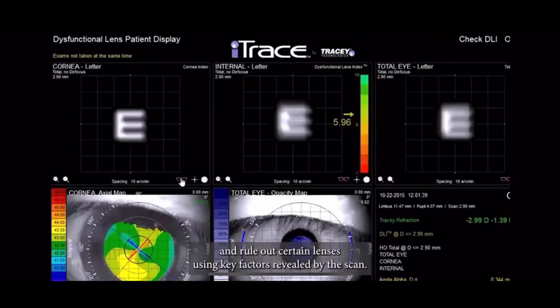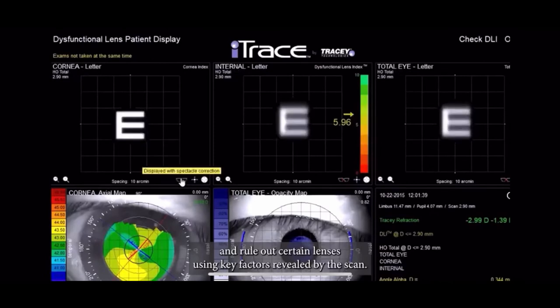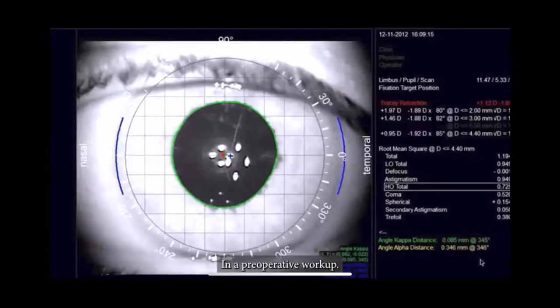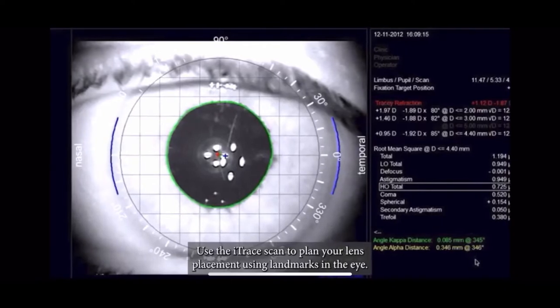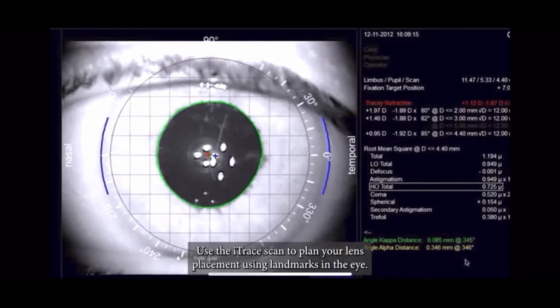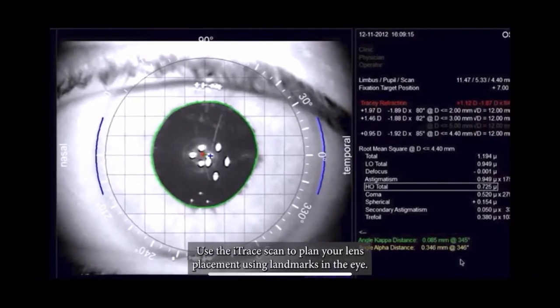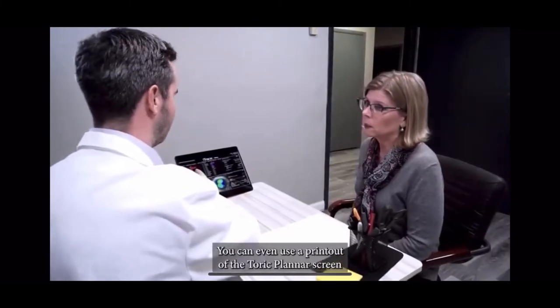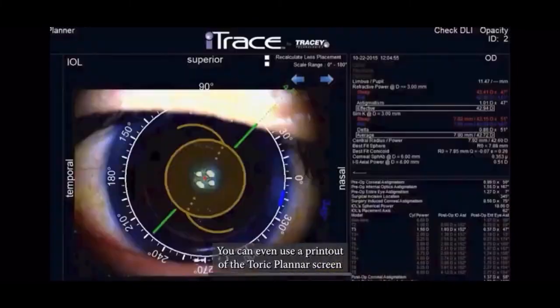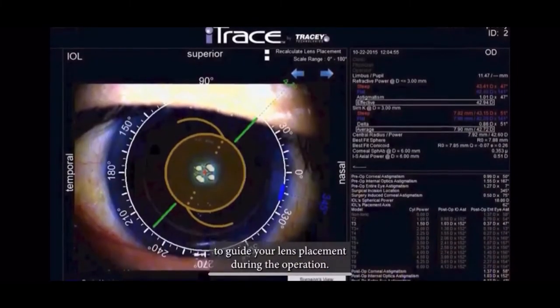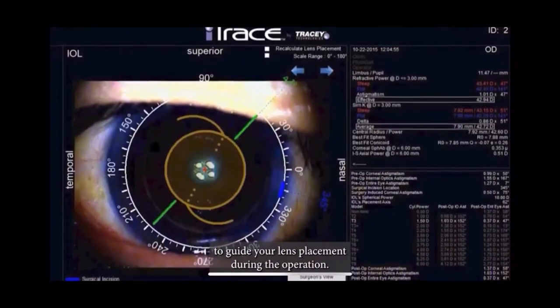Rule out certain lenses using key factors revealed by the scan. In a preoperative workup, use the iTrace scan to plan your lens placement using landmarks in the eye. You can even use a printout of the TORIC plan or screen to guide your lens placement during the operation.